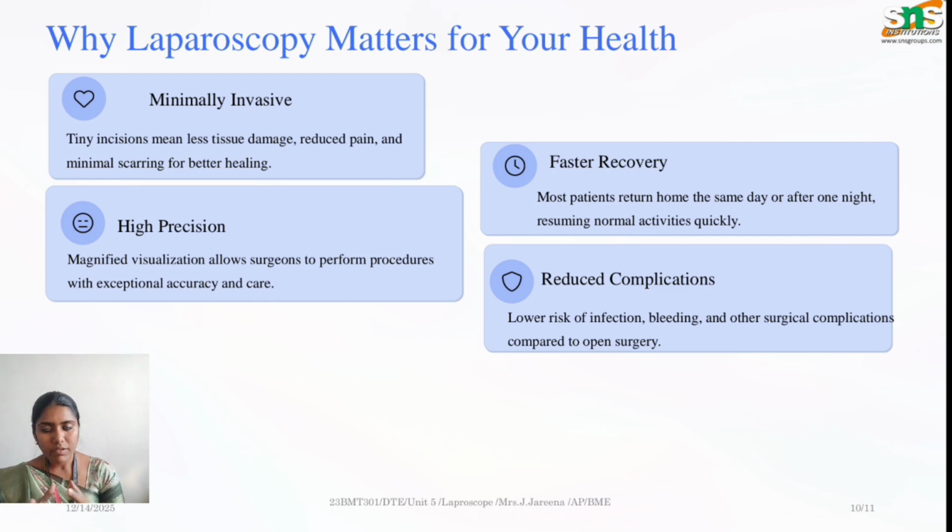Fast recovery is also very much possible in laparoscopy, because it involves a very small incision. Patients can return home on the same day, or at most in 1 or 2 days. And we have far fewer complications compared to open surgery. The reason is that we are not making very large cuts, so there won't be huge blood loss. So the complication associated with this minimally invasive type is very low compared to open surgery.